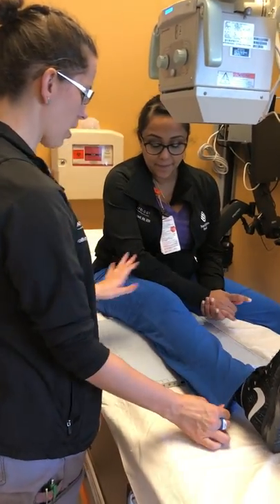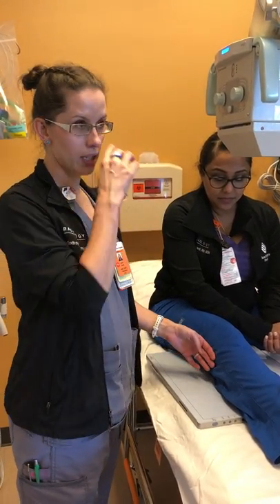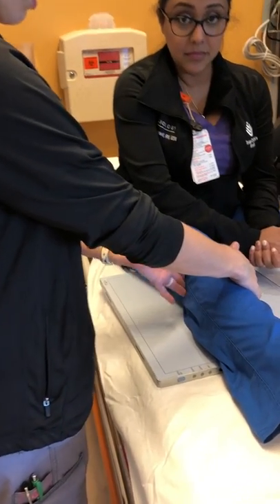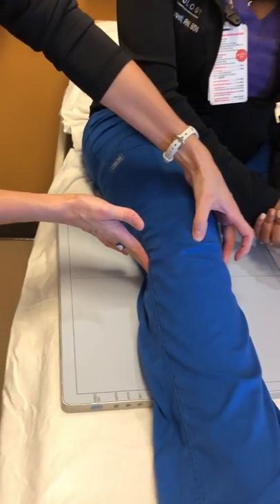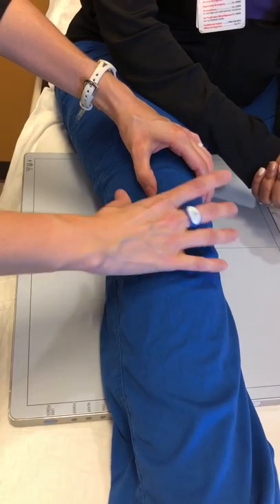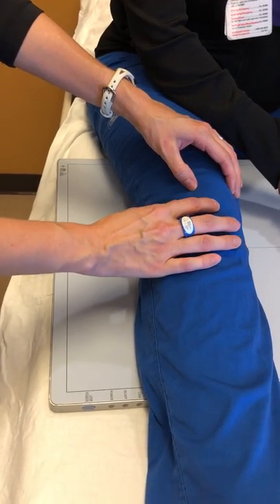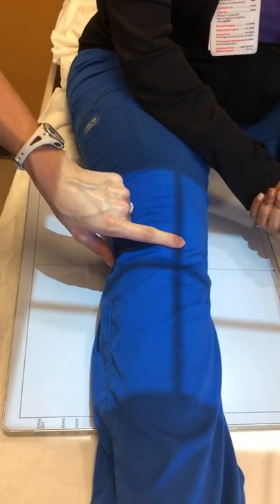Routinely for knee x-rays we have patients take off their pants and socks so we can see the knee directly. In some cases you can feel for bony landmarks instead. I'm going to feel for both the medial and lateral condyles of the knee, and also the patella. If you're not sure where the patella is — say there's a lot of swelling — you can manipulate it slightly to feel the apex of the patella.